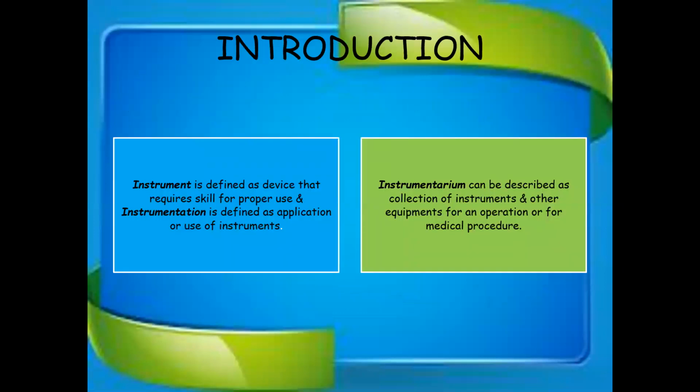Coming on to the introduction. An instrument is defined as a device that requires skill for proper use, and instrumentation is defined as the application or use of an instrument. The term instrumentarium refers to the collection of instruments and other equipment for an operation or a medical procedure.